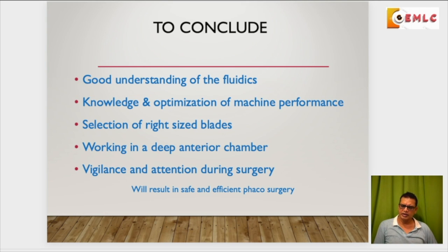And vigilance and attention during surgery is very important. You should go slow, be very, very meticulous at all steps, and that will ultimately result in extremely safe and efficient phacoemulsification. I'd like to stop here.